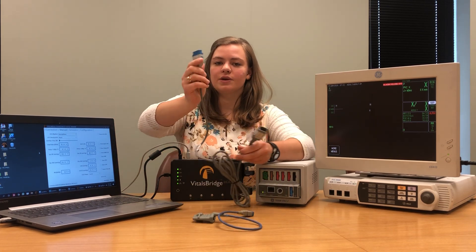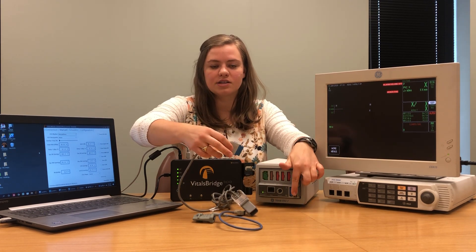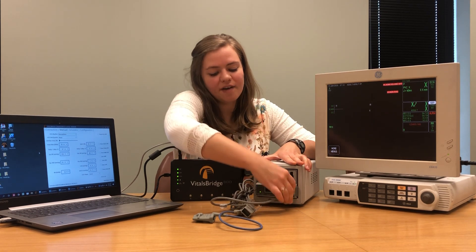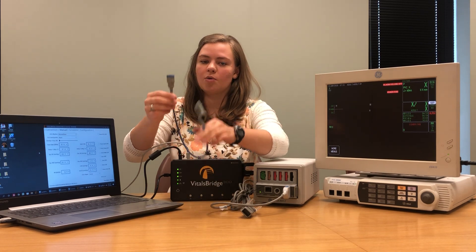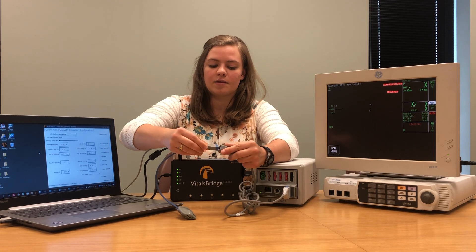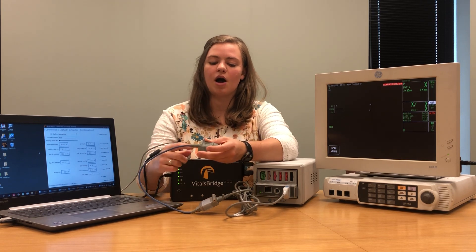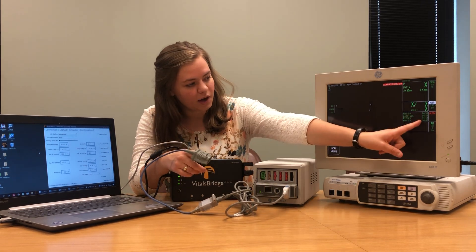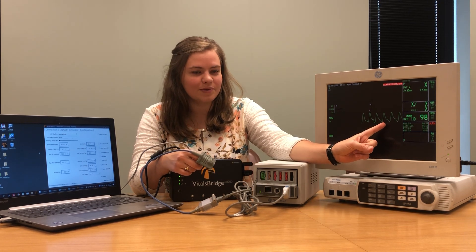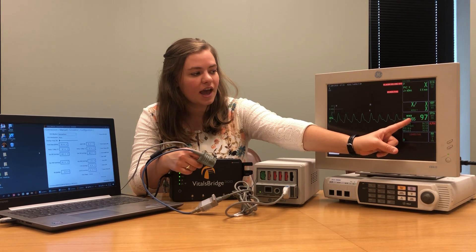The first thing you're going to do is connect your SPO2 cable to the patient monitor where it says SPO2. Once you have that plugged in, take your SPO2 probe and plug it into the other end of the cable. Once it's all been connected, put the SPO2 probe on your finger and make sure that you get a reading on your patient monitor. You'll notice how we have an SPO2 waveform as well as an SPO2 saturation percentage and a heart rate.